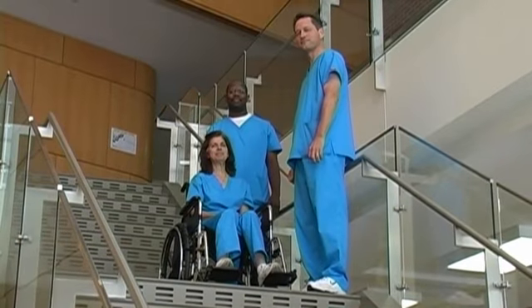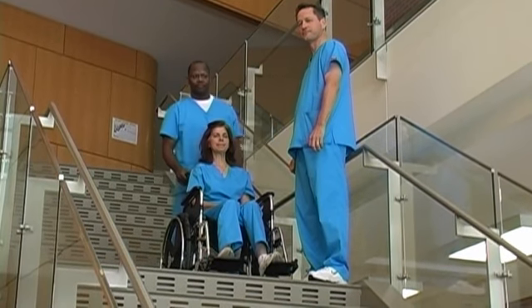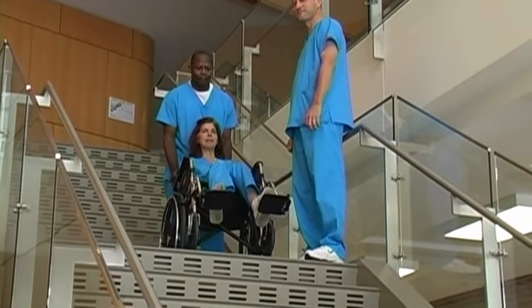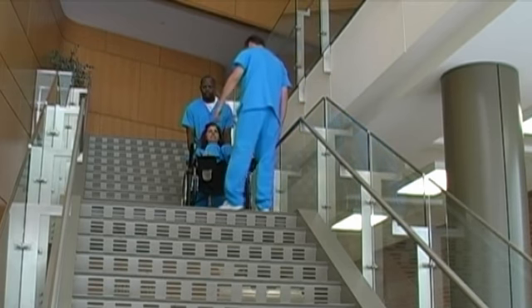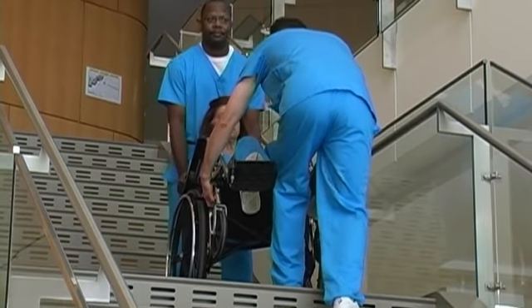Assisted wheelchair down the steps. One person moves behind the wheelchair, places one foot on the tilt bar, and pushes down while pulling back on the handles, tilting the wheelchair backward. The other person grabs the wheelchair frame and slowly brings it forward until the back wheels are at the edge of the step.